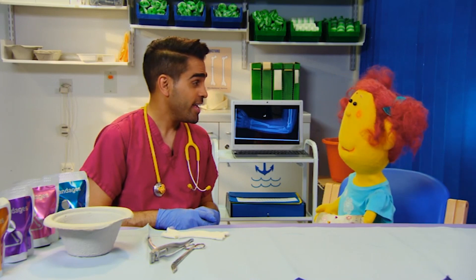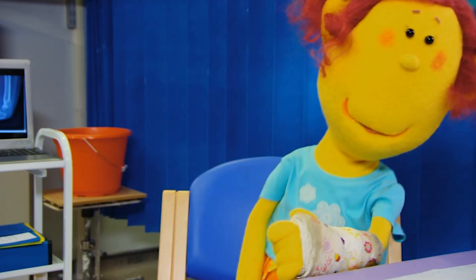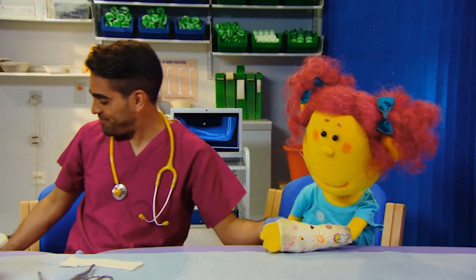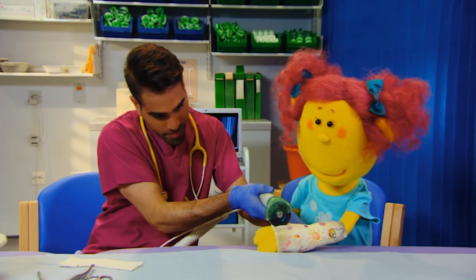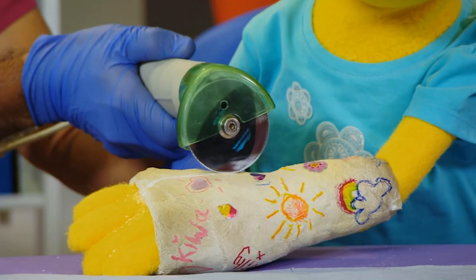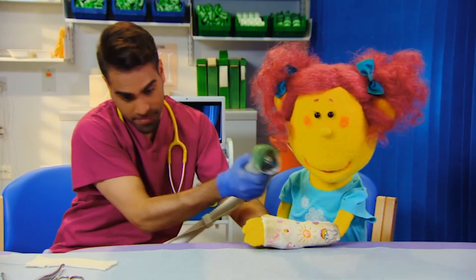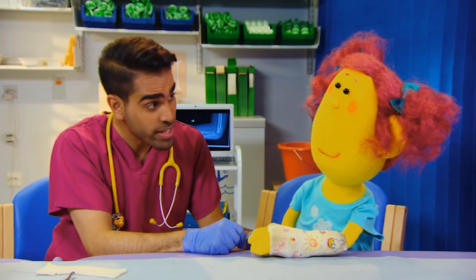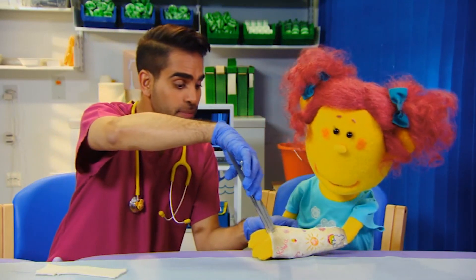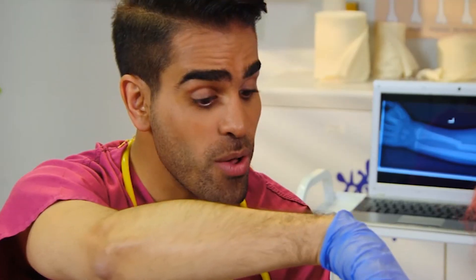Will I feel anything, Dr. Ange? It will feel tingly and ticklish and it will make a little bit of noise, but it definitely won't hurt. Are you ready to give it a go? OK. It feels funny. And now we very carefully open up the cast and take it off your arm. It tickles. There we go.